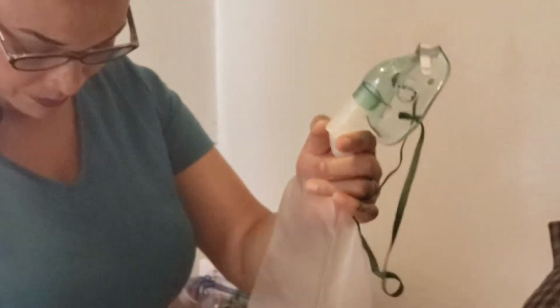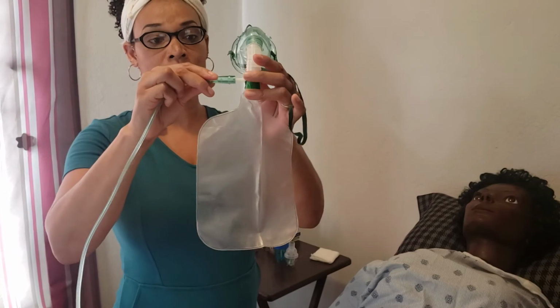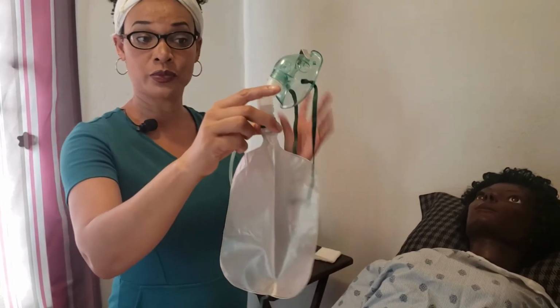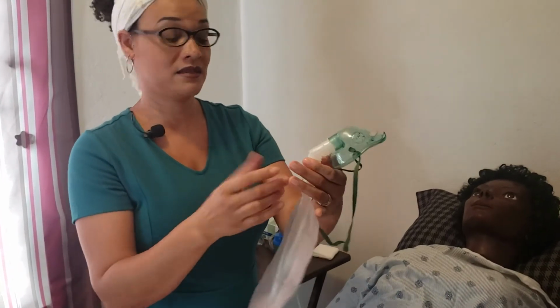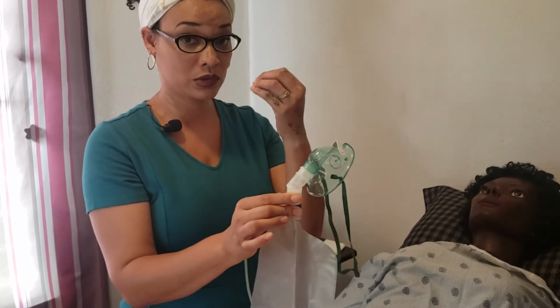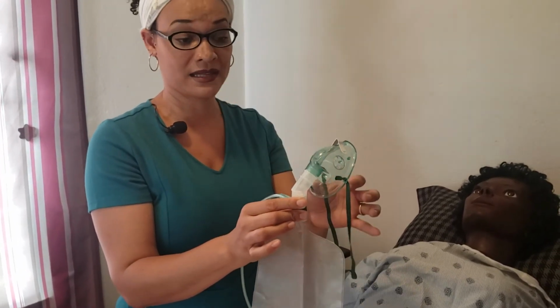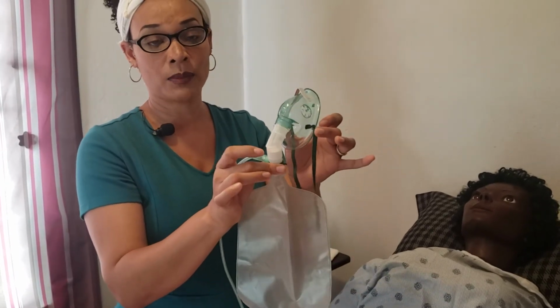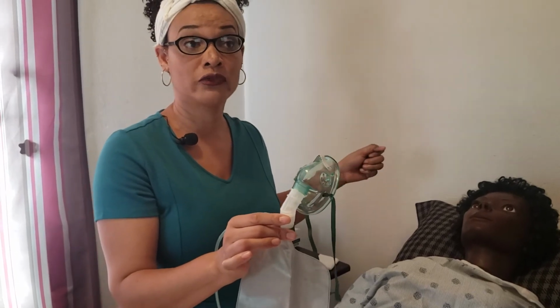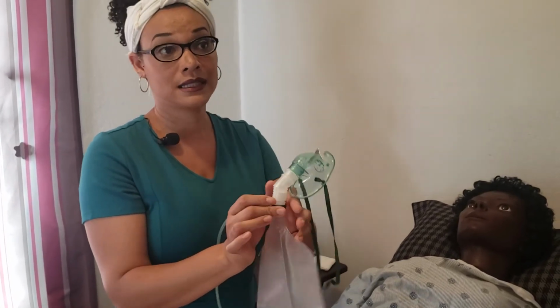So in order to set this up, you are going to connect your tubing directly to the bag and then connect it to your oxygen source, which should be humidified. In some cases, it may not be, but humidified air is much better because it would prevent nosebleeds and drying out of the nasal passages. So once you have this set up, you don't quite attach it to the patient yet. You need to turn that oxygen rate to flow somewhere between 10 and 15 liters per minute so that the reservoir bag is filled before you put it onto the patient's face.